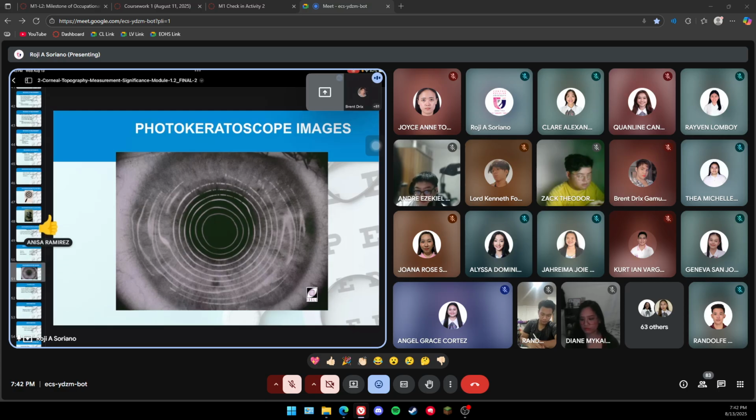All right. But one downside of tear-dependent machines could be the tears drying up, right? That causes distortion. So you have to understand there are machines that are tear dependent. But usually this represents the shape of the cornea. So very good, very good. Very good, Brent. Very good.